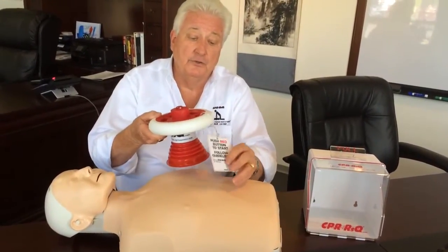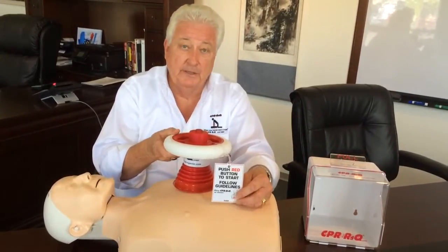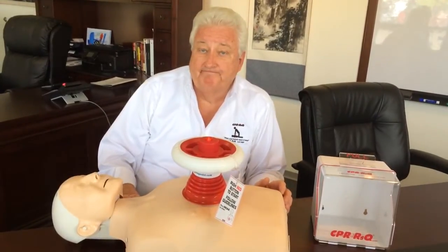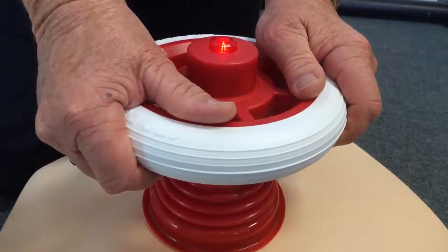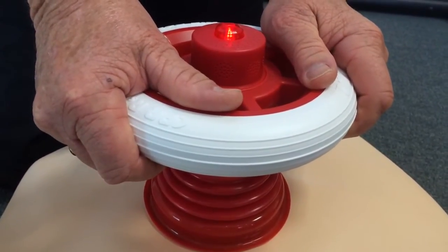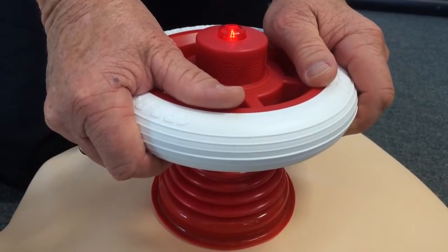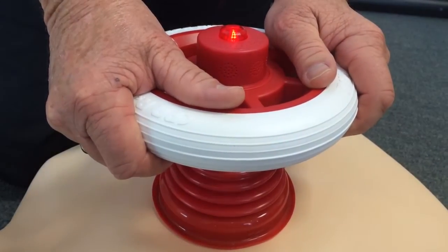The attached card shows you how to place the device as directed. There's a small target on the card that shows you exactly where on the sternum to push it and activate. Push the red button. Place CPR Rescue as shown on the card. You should do at least 200 chest compressions in two minutes at a depth of at least two inches.